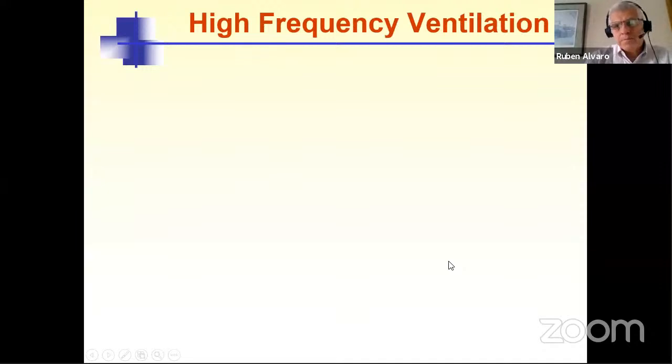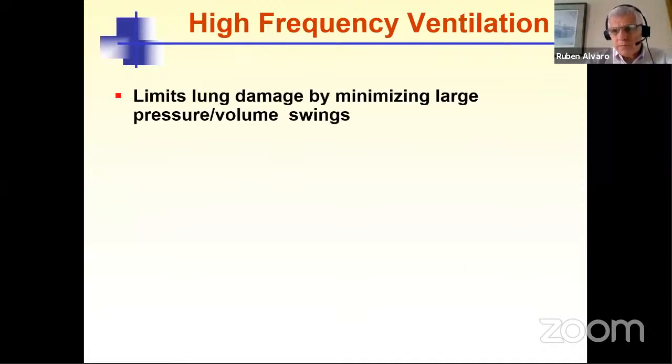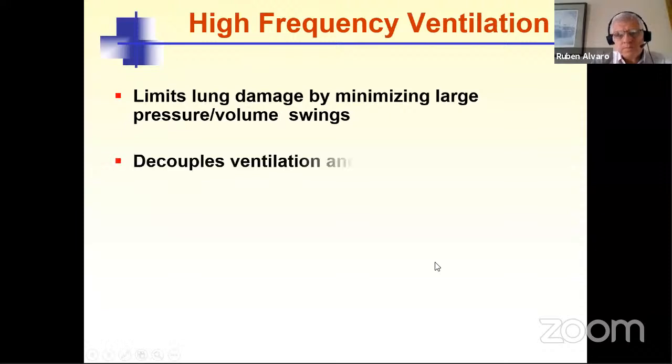So, general principles about high frequency ventilation. We know that high frequency ventilation limits lung damage by minimizing large pressure volume swings. We know also that high frequency ventilation, different than conventional ventilation, decouples ventilation and oxygenation.